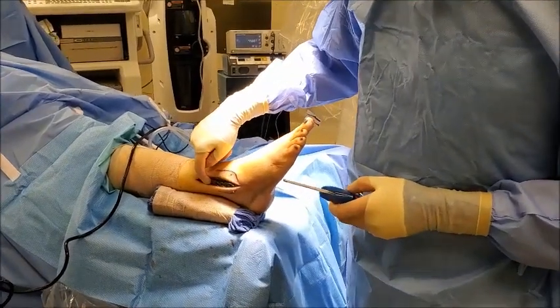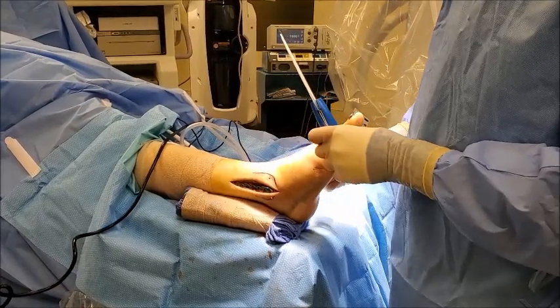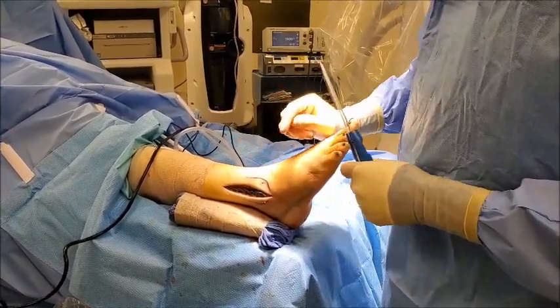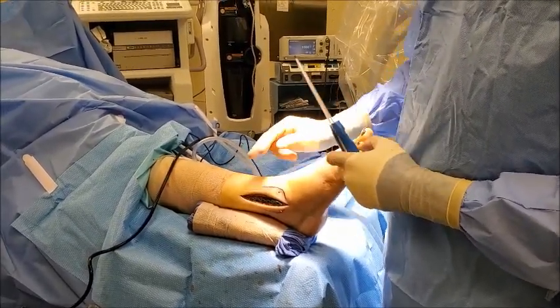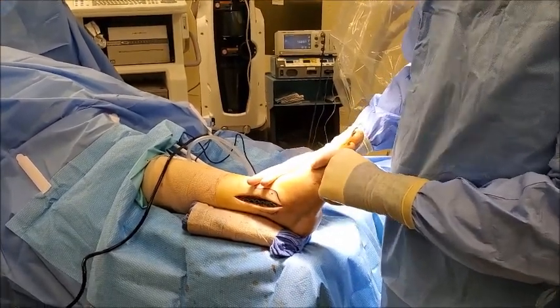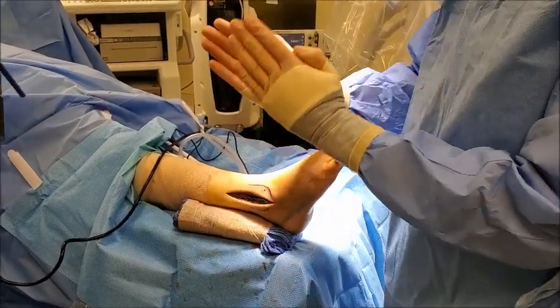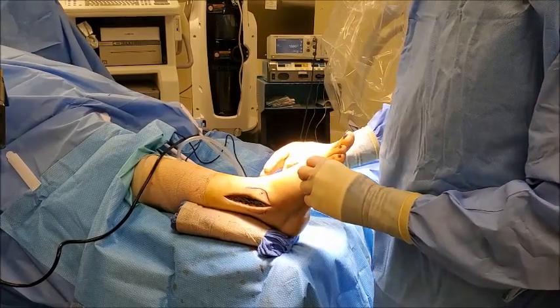At this point in the procedure, we've completed the repair by putting a plate and screws on the outside of the ankle — the fibula — and there are two small screws crossing the medial malleolar fracture. The last portion of this procedure will be binding a small ligament back together along the middle of the leg. The two long bones, called the tibia and the fibula, are bound together by a ligamentous structure called the syndesmosis. During one of these injuries, that becomes torn. If you don't repair it, the ankle becomes very unstable even though we fix the fractures, and patients will develop arthritis.